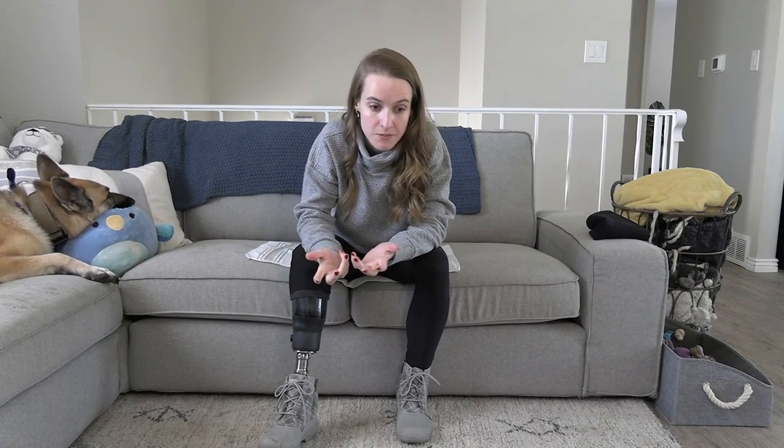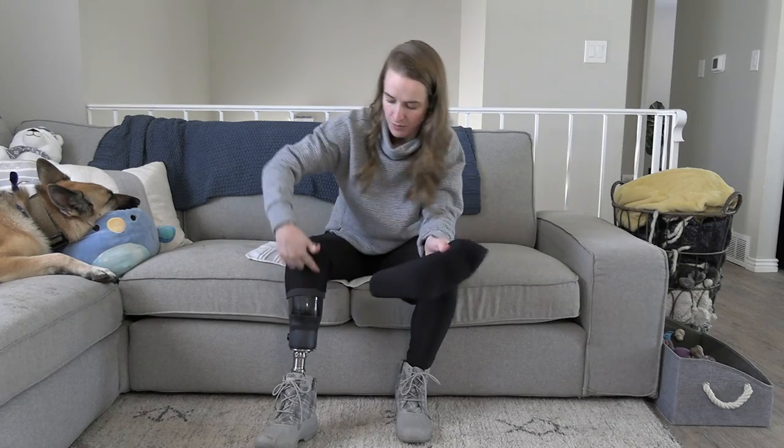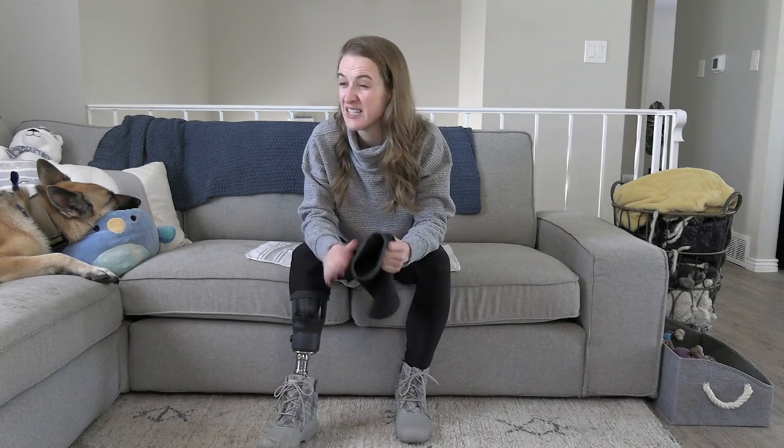So every prosthetic attachment system has pros and cons, right? A big pro of this for me is that it has been very comfortable at times, but it is also very prone to breaking. So these sleeves, which is the piece you see kind of coming up my leg here, if they get even the tiniest hint of a hole in them, it can let air in and mess with that suction. It gets incredibly uncomfortable very quickly. These are not cheap. Insurance pays for 2 every 6 months. They generally wear out for me after like 2 months.